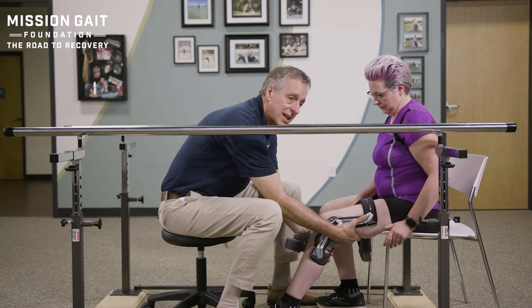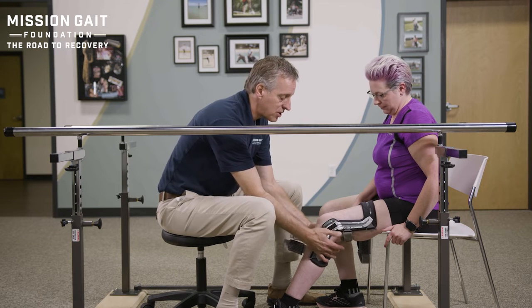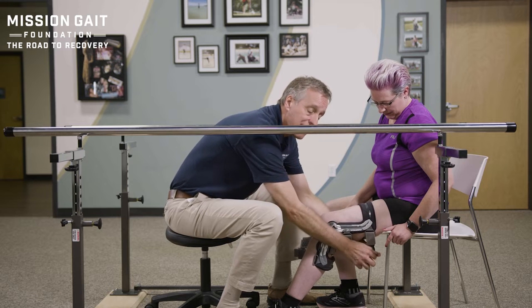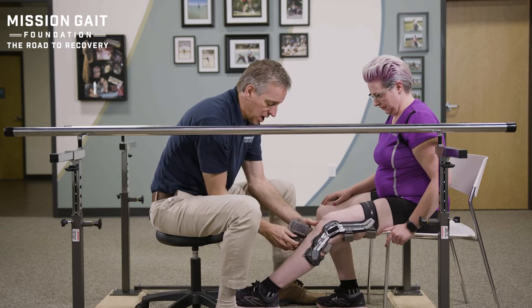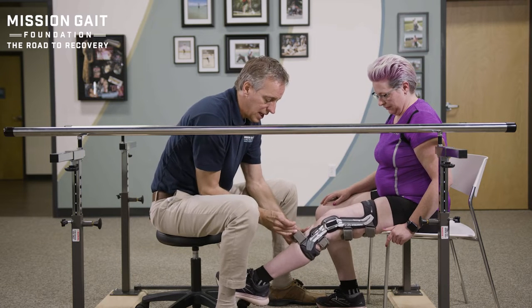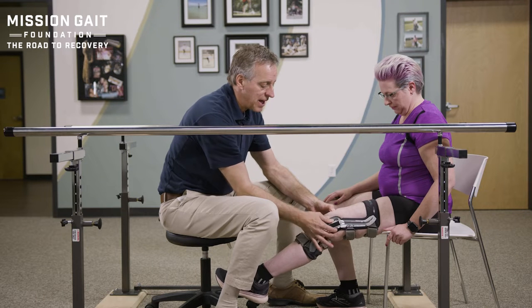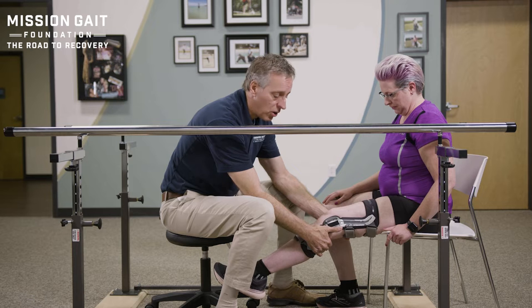From there, you're going to stabilize and tighten the two back straps — just take up the slack when the joint is in the correct position — then come all the way around the back and tighten up the top and bottom straps. These straps do not have to be a tourniquet effect. You aren't trying to cut off circulation; you just want to take up the slack. If I have the knee joint in the right position, it's centered front to back, aligned to the top of the kneecap, and my back straps are holding that position.